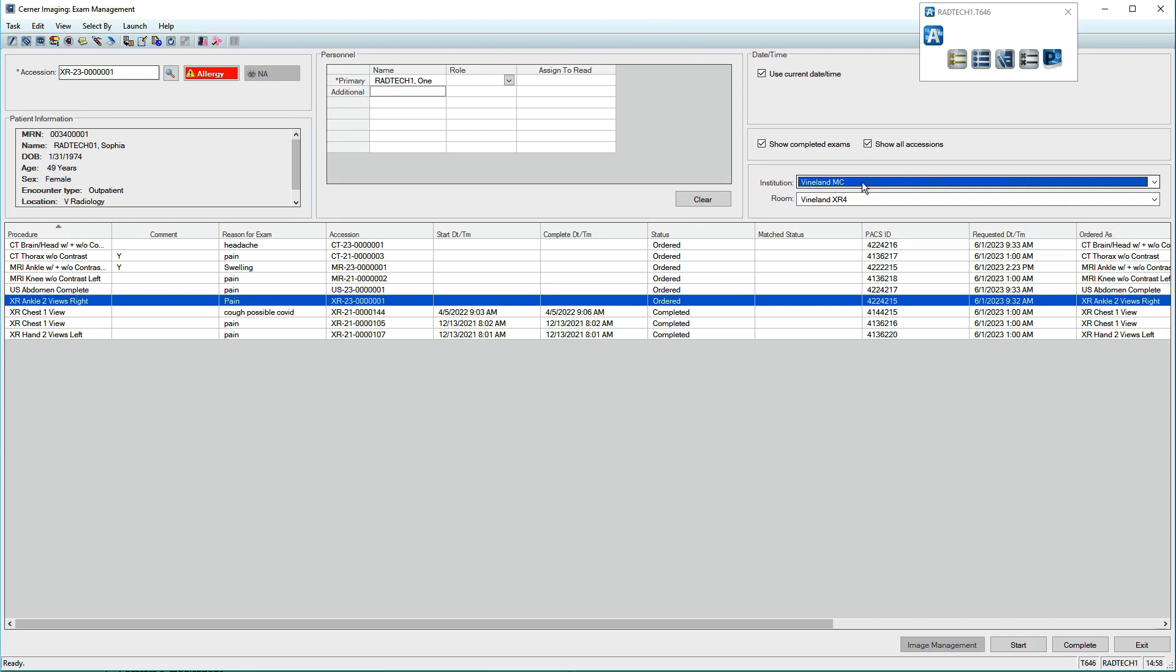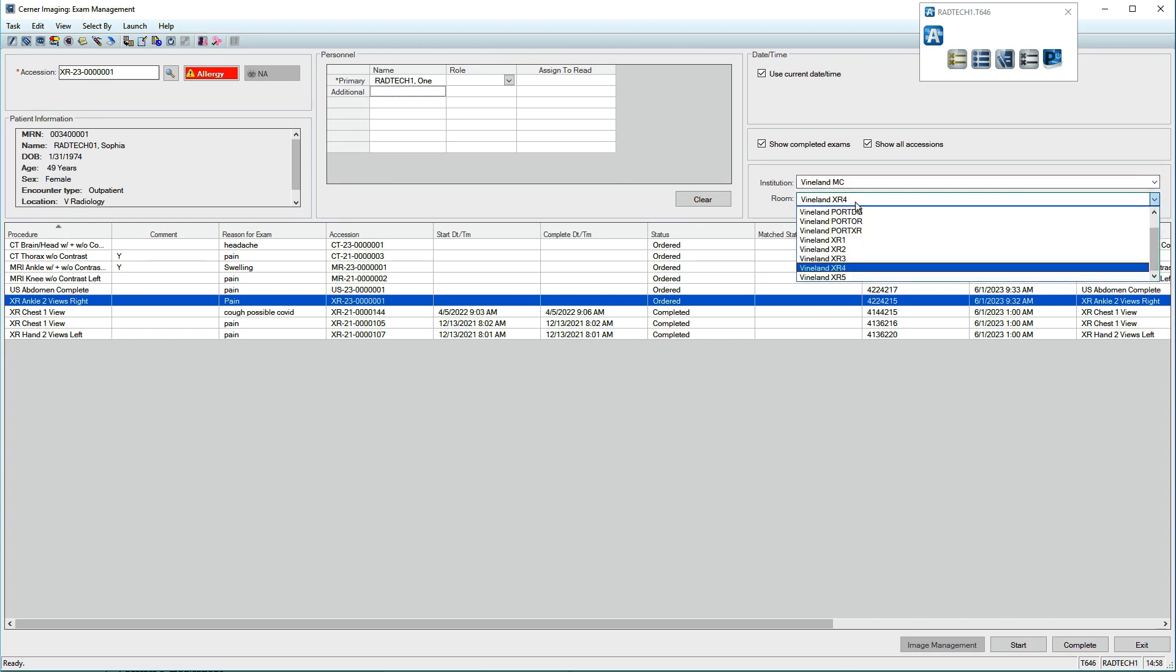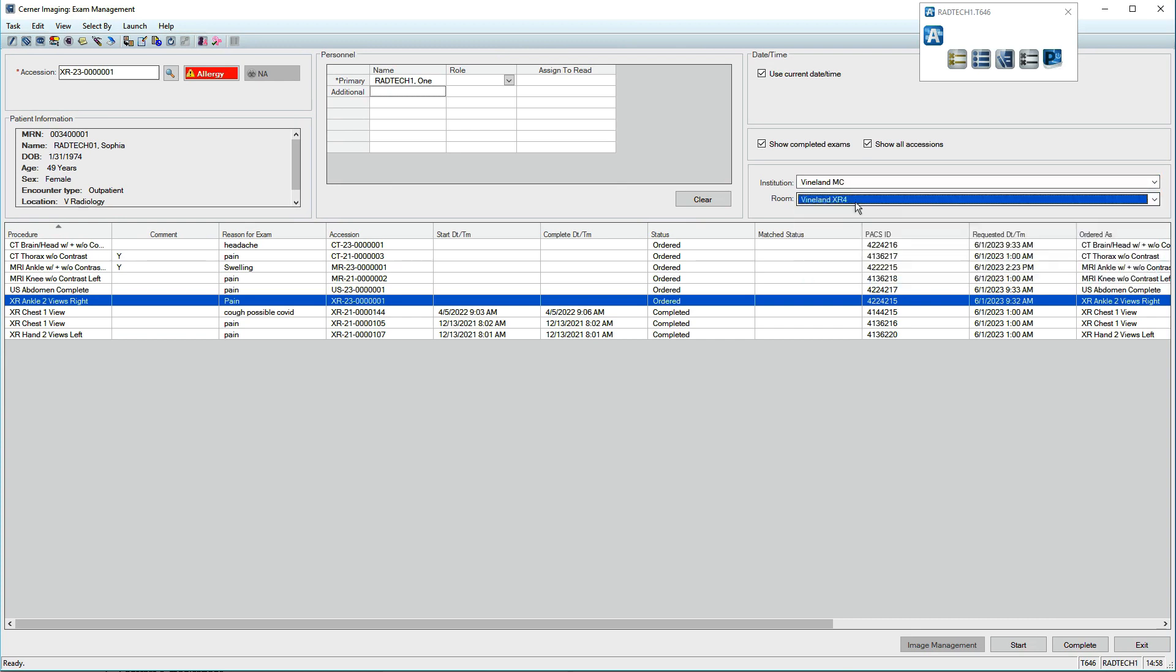Next, ensure the institution and room are accurate. Occasionally, patients present with an order for an exam that's inappropriate. After consulting with the patient's physician, these orders can be replaced.